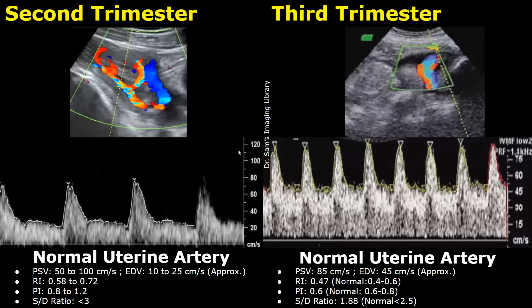The resistive index is usually between 0.58 to 0.72. The pulsatility index is between 0.8 to 1.2, and the SD ratio is normally less than 3.